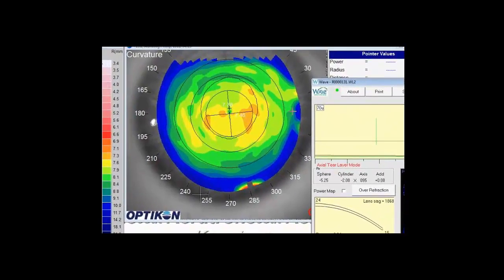So in deciding whether you're going to use prism or not, there are a couple methods you can use. One is to look at the initial topography and look at the alignment of the lens. So in this case, we have almost two diopters of corneal cylinder. The cylinder is very centrally located and as we move out towards five and seven millimeters of the cornea, you'll notice there's not much torsity. So this lens will probably rotate on the eye.